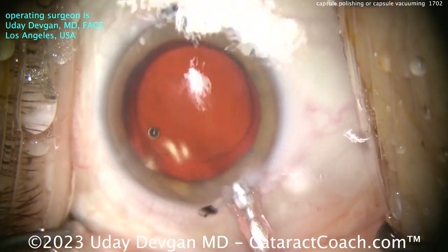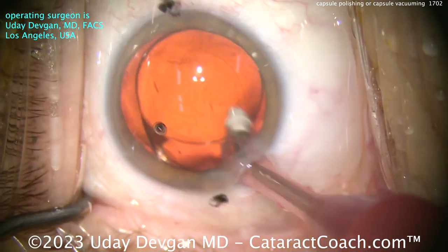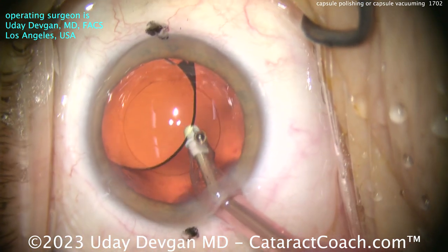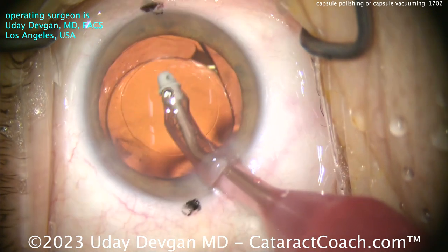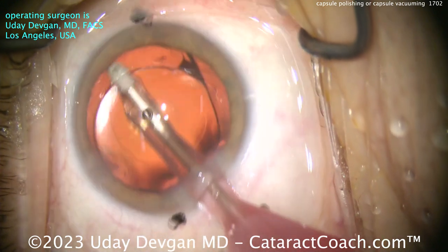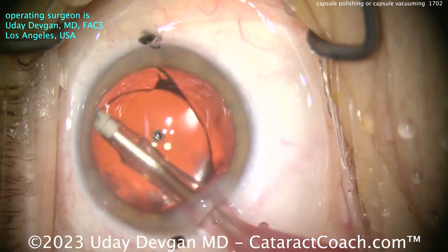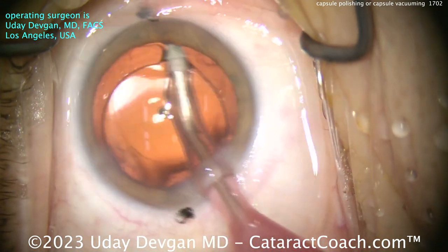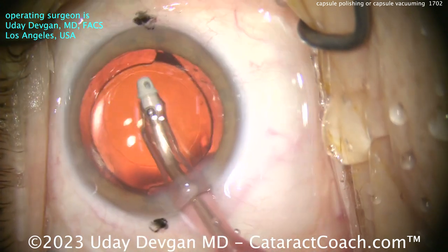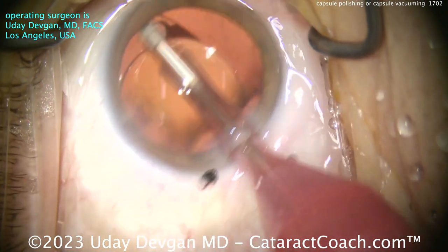Watch as I put the IA probe back in the eye. As we get back inside the eye, we take out the viscoelastic from behind the lens — lift that up, vacuum all that out. Look at the undersurface of the anterior capsular rim — there's still some lens debris there. So I'll now go with my foot barely on the vacuum. Look at that — more material. I think the vacuum of the IA tip is probably more effective than just the mechanical scraping of a capsule polishing instrument.